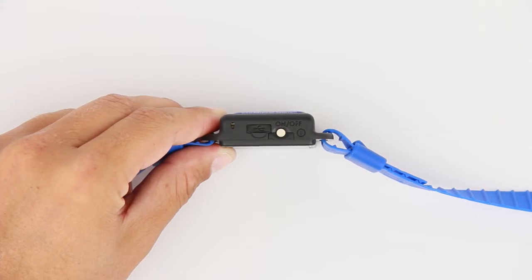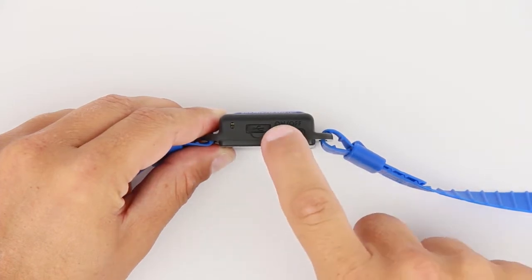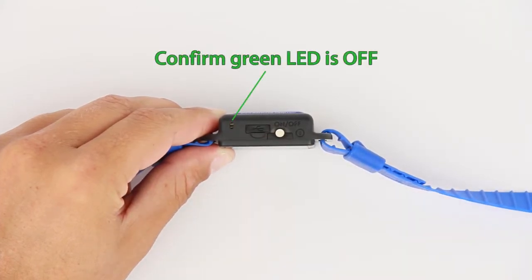When you wake up, turn the device off by quick-pressing the on button and confirm the green LED is off.